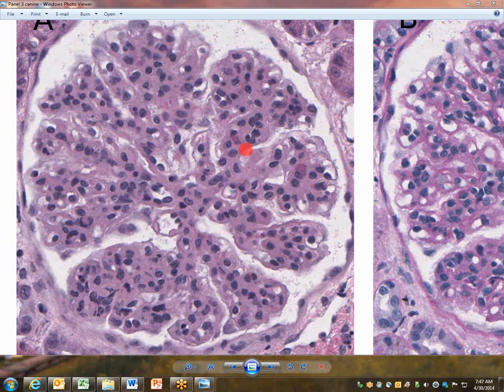I'd point out two things further. One is the sense of lobulation here, which shows up in this disease. And the other thing, although we'll see it more with other stains, is that the cellularity, which is greatly mesangial, also comes with a paucity of patent capillary lumens. Yep. Okay. Great, thank you.